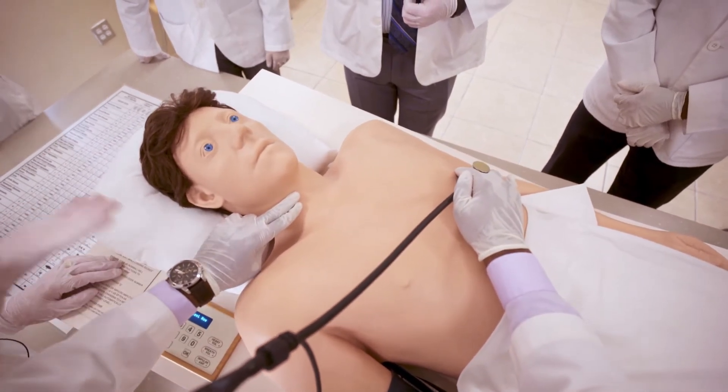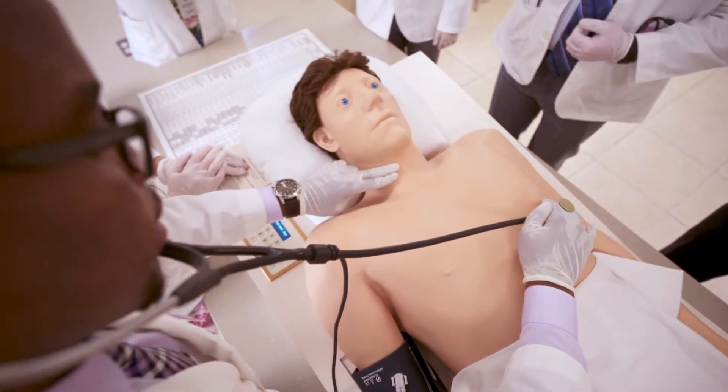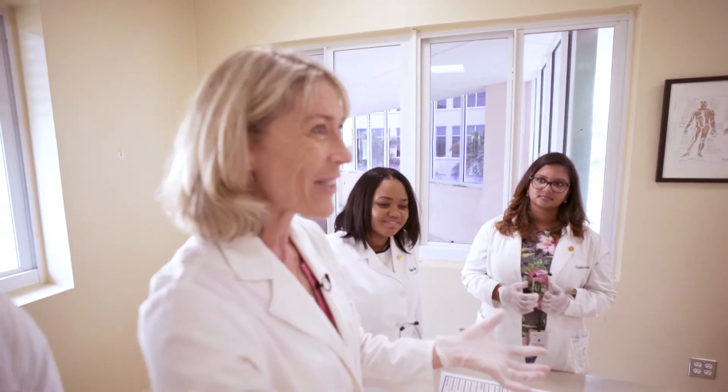You should barely be able to hear the murmur now. So you can work out what you're going to auscultate before you actually put your stethoscope on the patient's chest, and that is by far the best way to do it. Otherwise, you're faced with a murmur and you don't know what it is that you're dealing with. When you actually auscultate, you're just confirming.